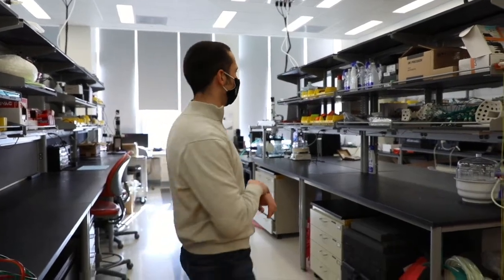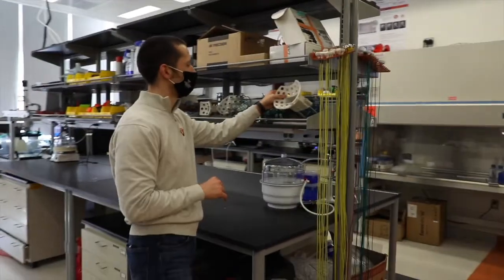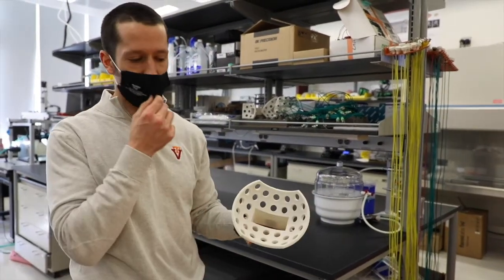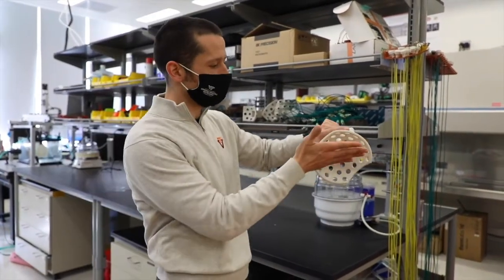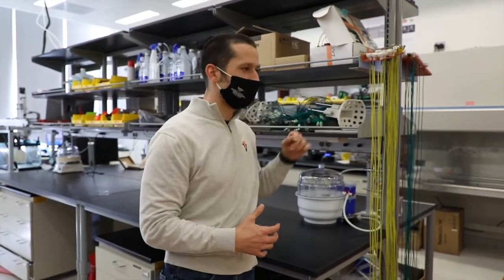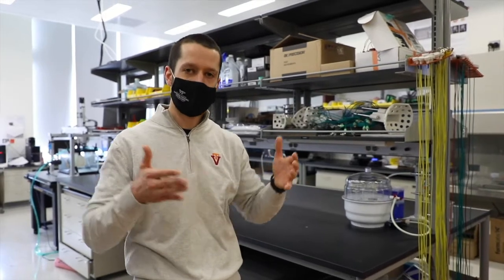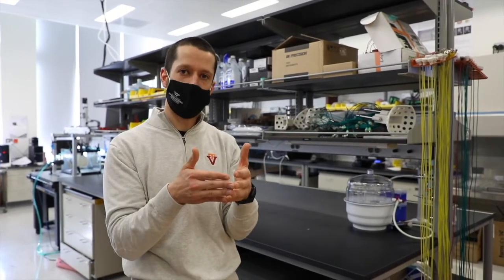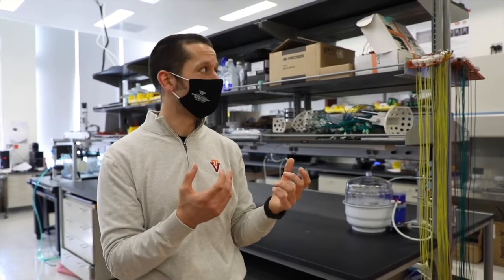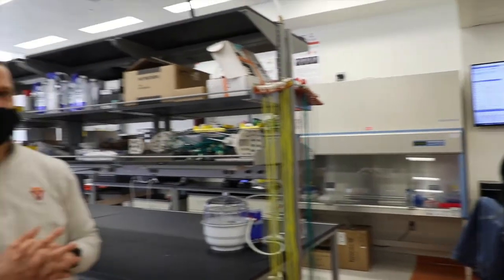In contrast, and this is an unpopulated transducer here, but you can see this is one of the prototype scaffolds we make for our devices, which is, you can see how it's focused down, like a curve, like a lens shape. And what this does is we use very high pressure sound waves that are focused down to a single point in the body. And this is to induce some bio effects. So most of our work is focused on generating these bubbles, which you can see up on the screen here in a second, or she'll show you there.